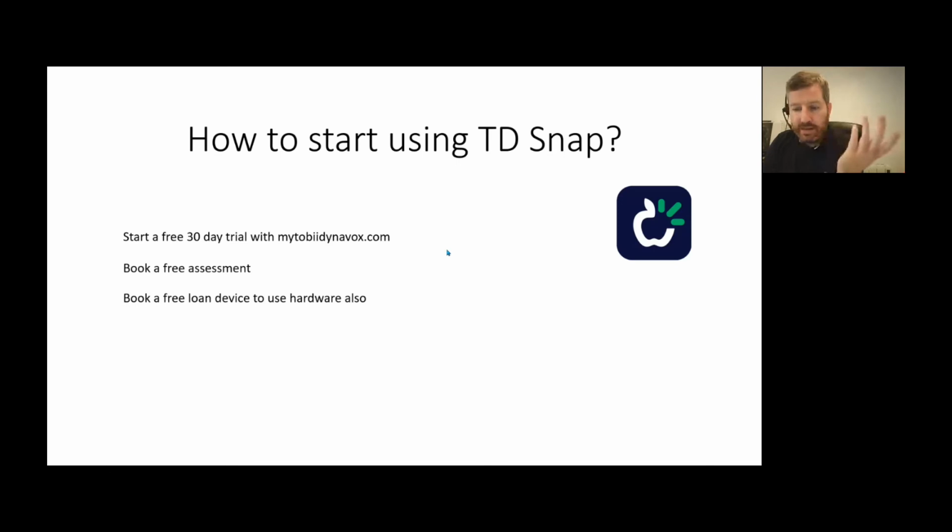You can book a free loan device. If you want to try the hardware as well, we'll send you out a device with software on it, and you can try that with your user. You can book free online training sessions or an in-house workshop. So we're happy if you want.